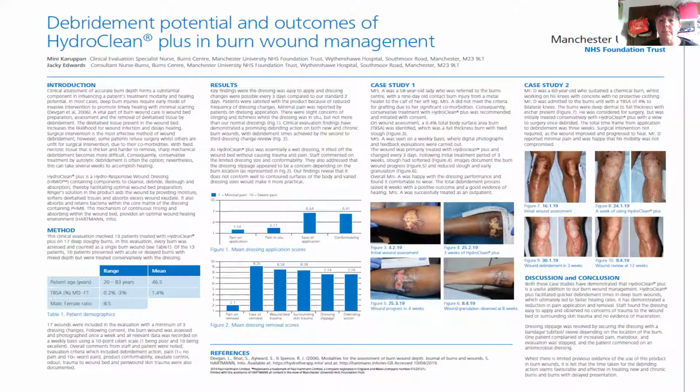The dressings themselves are limited slightly from a burns perspective in that they are of a certain size. They also, unfortunately, slightly have problems with conformability, but in reality, that is to do with the burns themselves. Burns patients get wounds in a whole variety of places, and they're not just in the standard areas that you would expect a wound to be. The problems with conformability were easily solved by adding extra tape over the dressing.